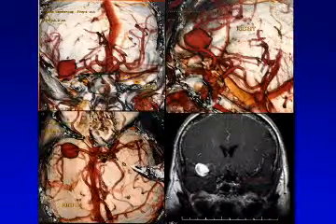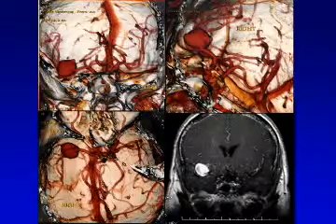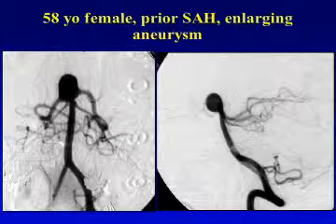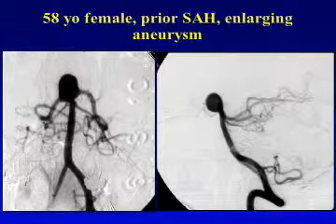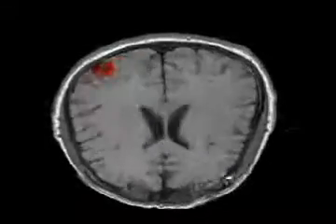And then probably 6 or 7 years ago we worked with our imaging group, and for a wide-based aneurysm like this, we were able to generate a CTA like this, and in fact could then have our 3D lab work out a video so we could try to appreciate the relationship of the aneurysm and the vessels coming out of the aneurysm to the skull base.